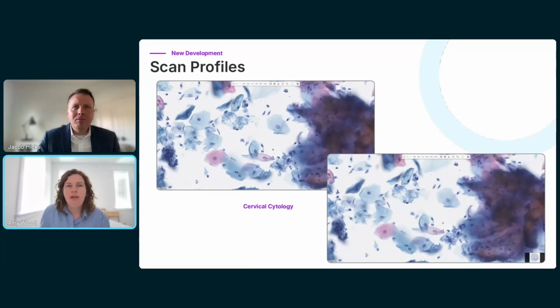So typically what we do is scan the same slide with multiple different settings so we can see which setting looks the best. Here you can see we're looking at a very similar sample, maybe kind of small for you, but let me highlight some differences here.